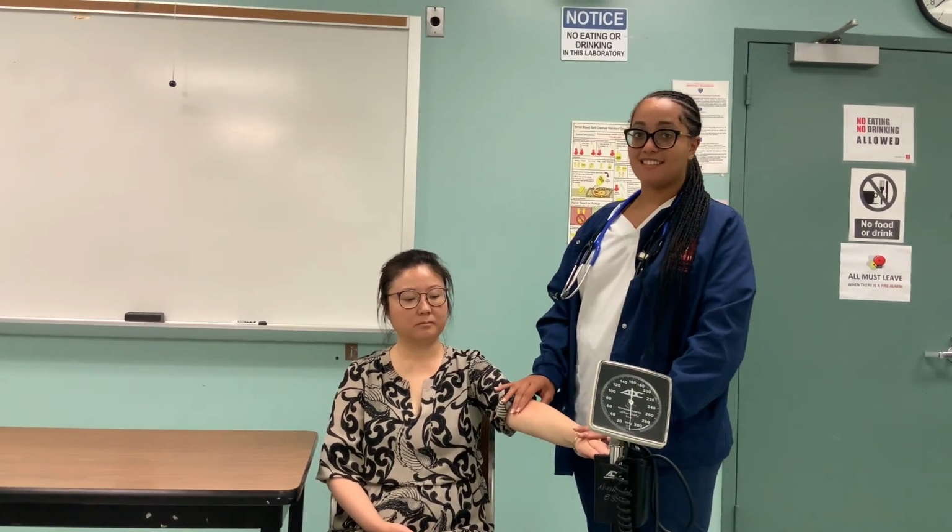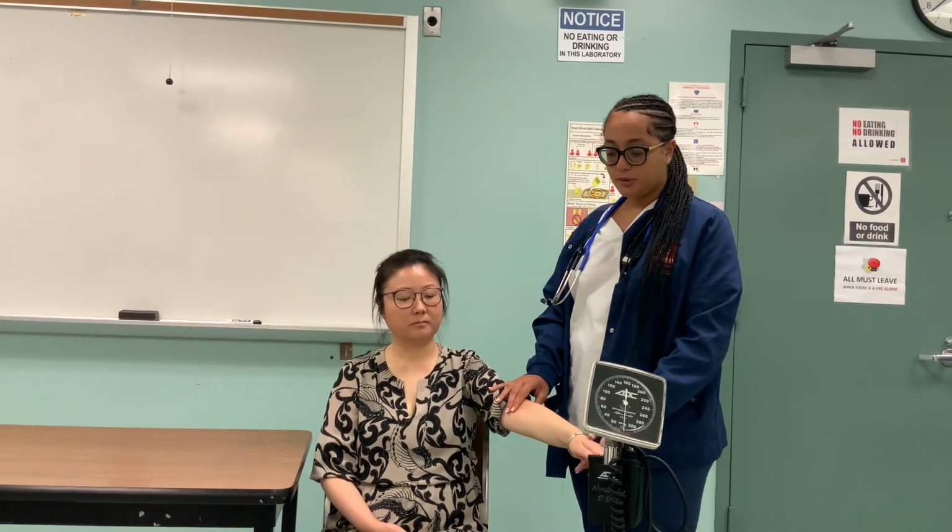But I'll be taking it on this hand, and you would ask, are you comfortable in this position? Yes. So then you would proceed and you would palpate over here for the radial pulse, and you're going to find it. And then you would want to estimate, based on their baseline of where their pulse was, where their systolic is going to be, and where you would pump 30 above their baseline.